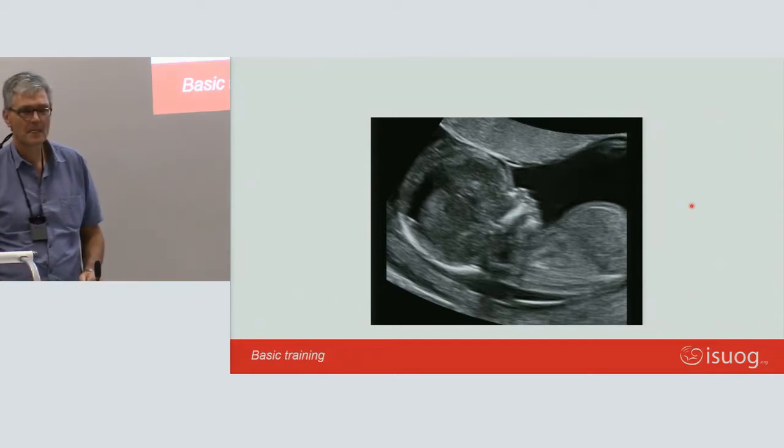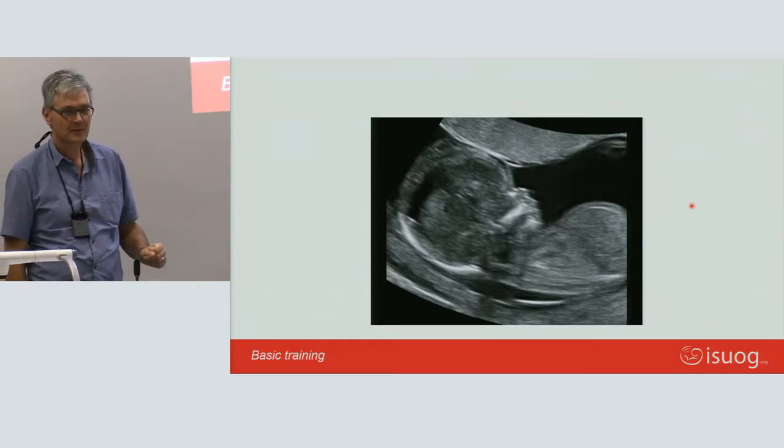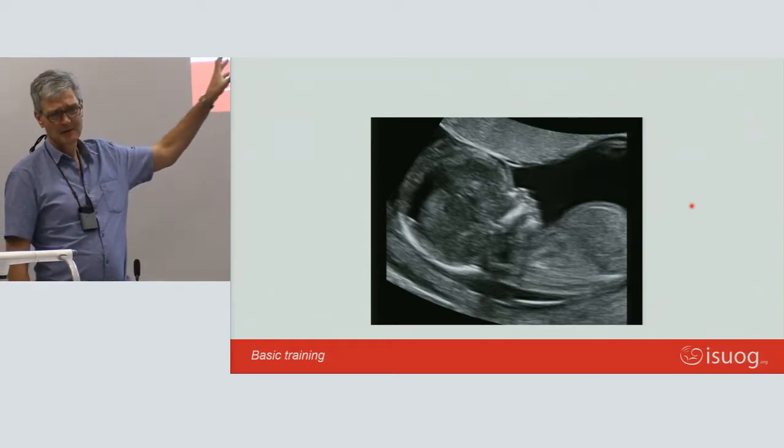This baby, nice profile or not so nice profile? What's wrong with this baby?